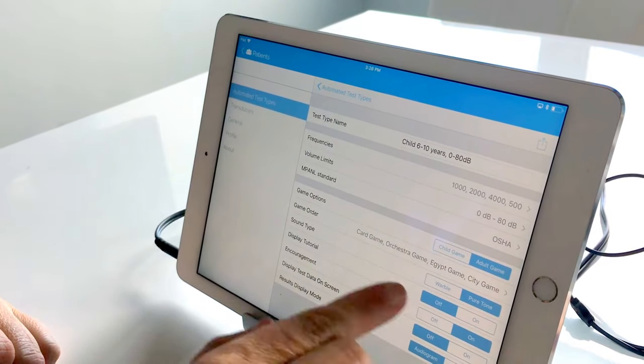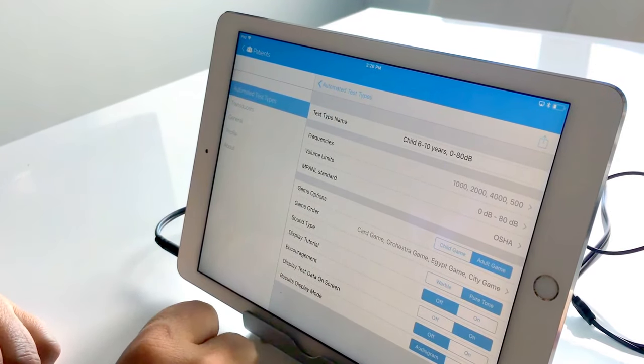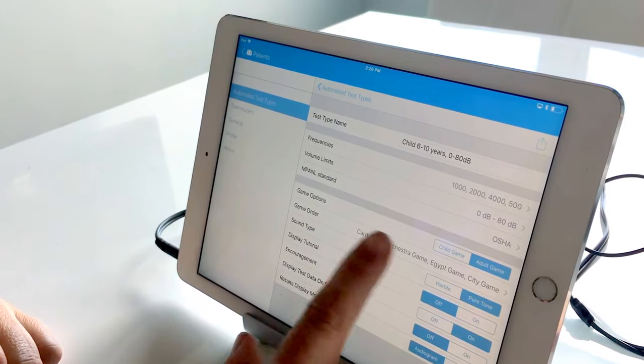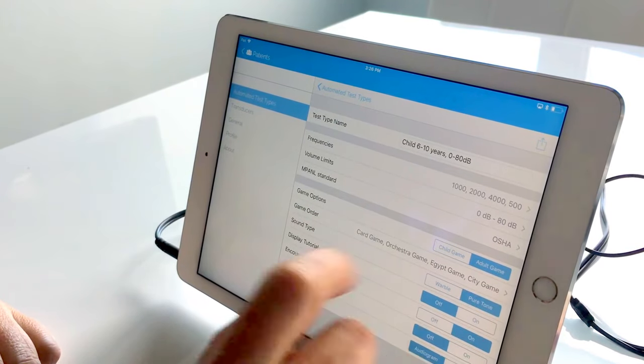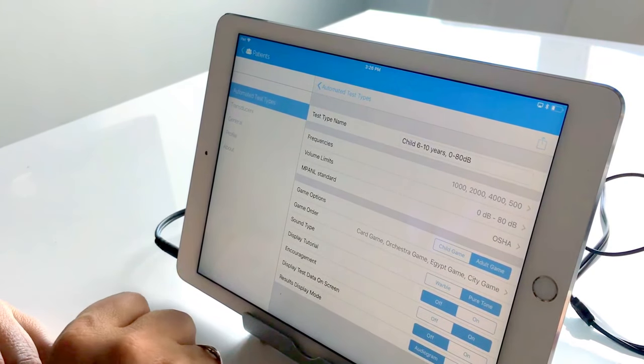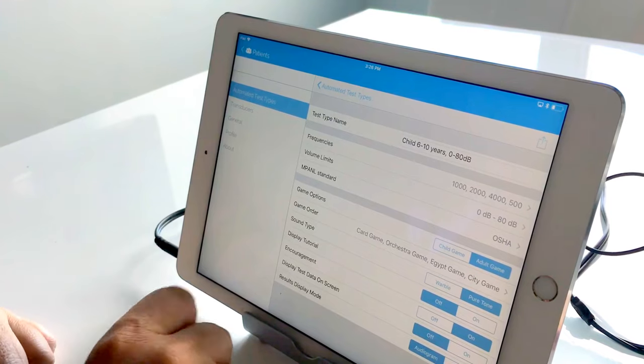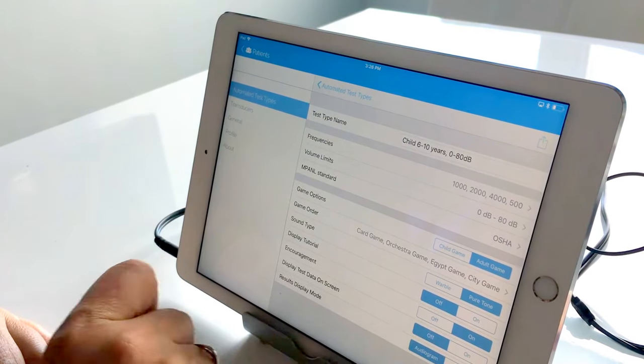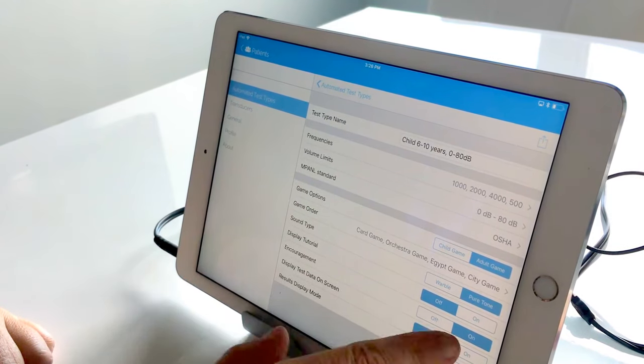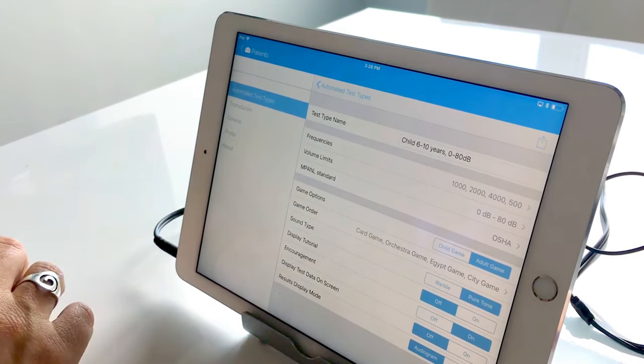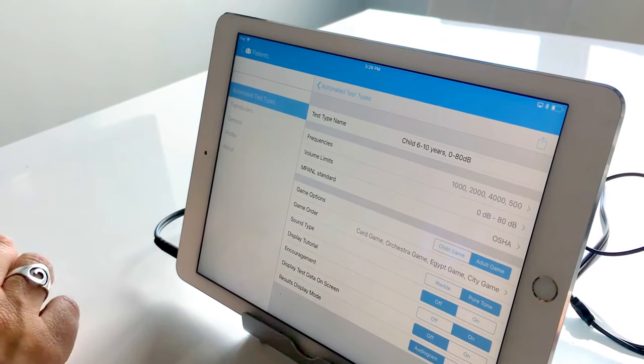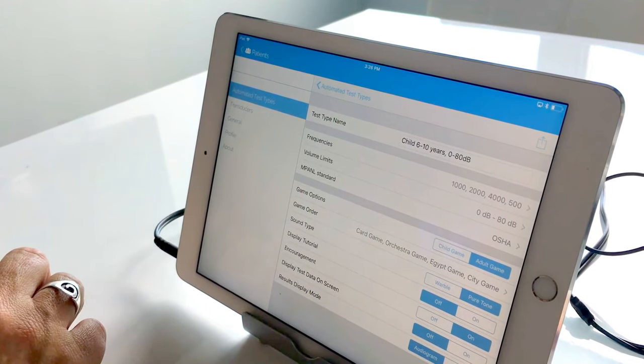The other settings down here are the same as the first one that I went through. Pure tone tutorial being off as it's more geared towards adults but the encouragement has been left on because even though these are older children they can still benefit from some encouragement.